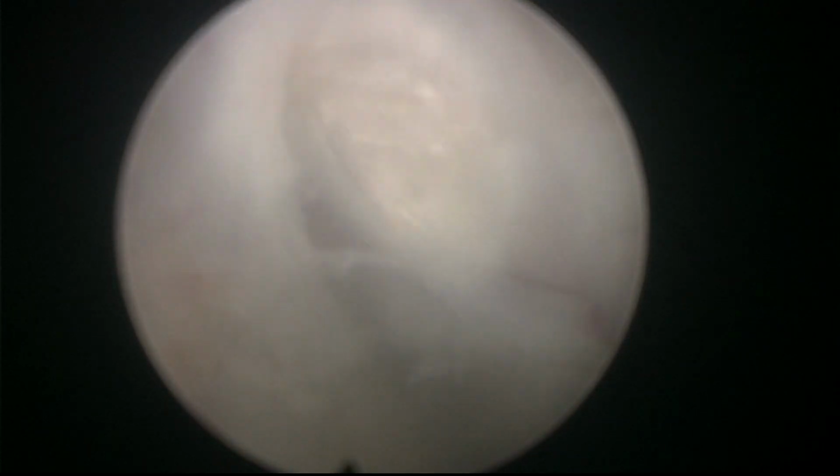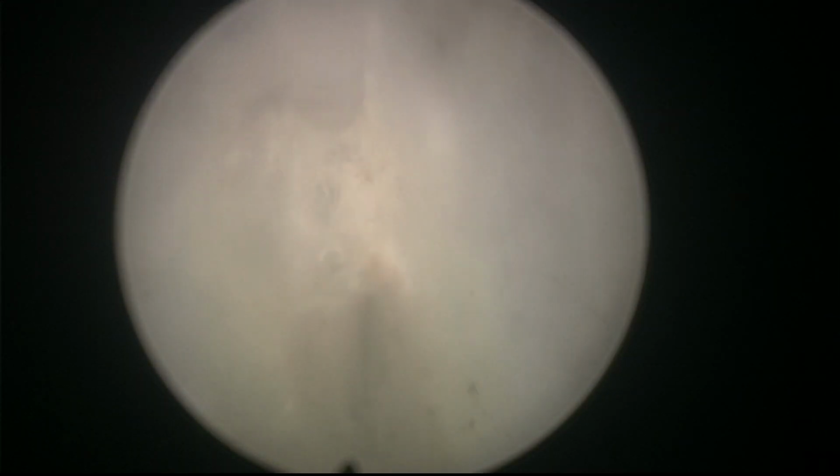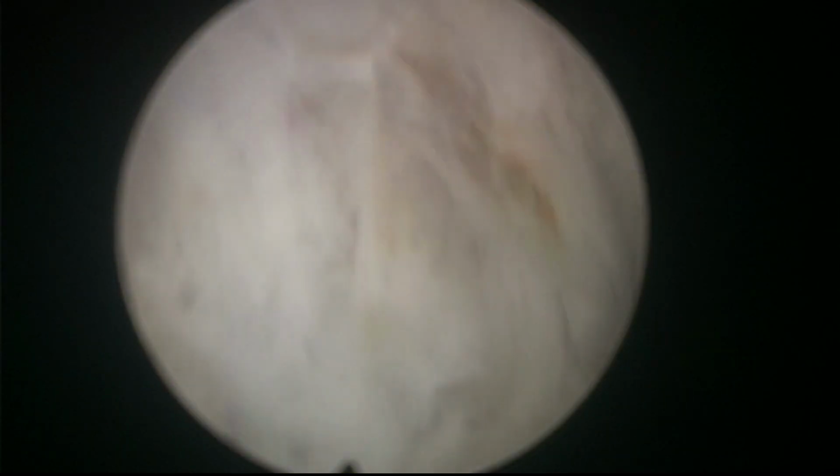Here, as in every obese patient, the mobility of the scope is a little bit limited by the fat pads in the perineum, in the legs, all around the prostate, the perineum, which is going to limit the mobility of the scope a little bit. Also, this colleague from the US told me that he used to do perineal urethrostomy.